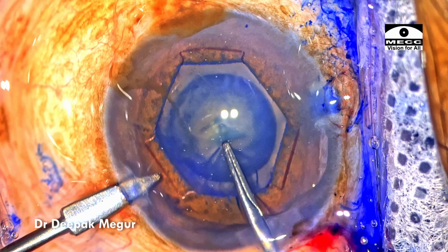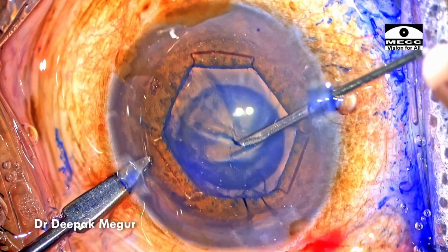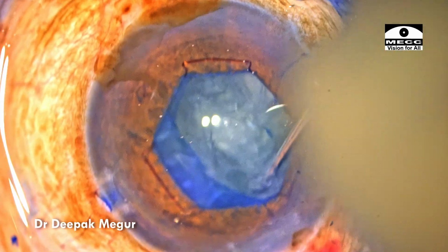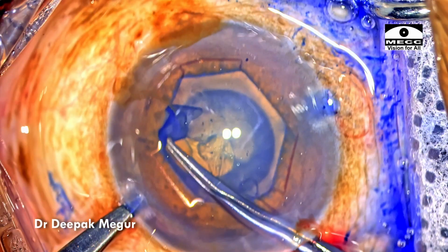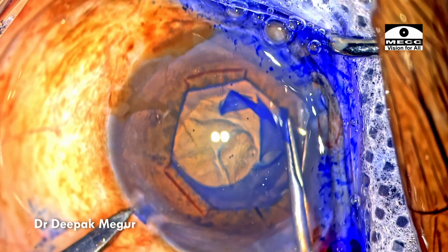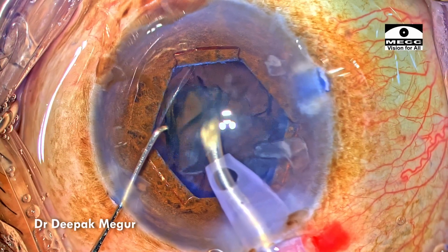Hi, I'm Dr. Deepak Megur, and let me take you through a case of a generalized zonular weakness in a case of pseudoexfoliation. These cases are very difficult to manage because the bag is not so loose that you need to sacrifice that. At the same time, the zonules will be very unhealthy and it's a progressive condition.